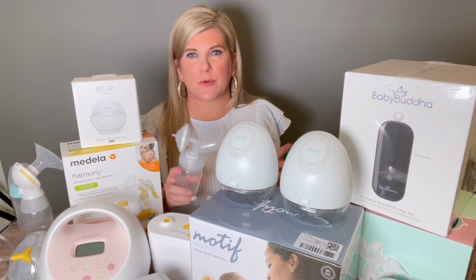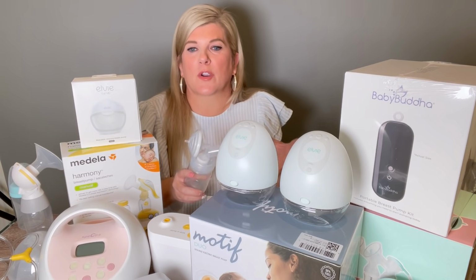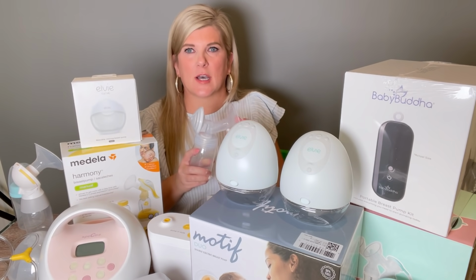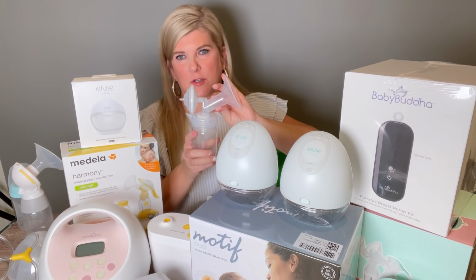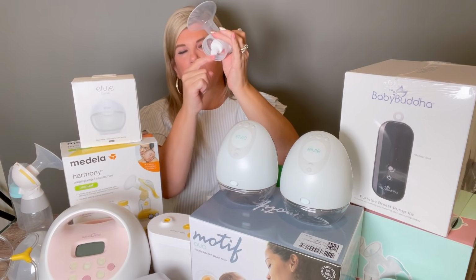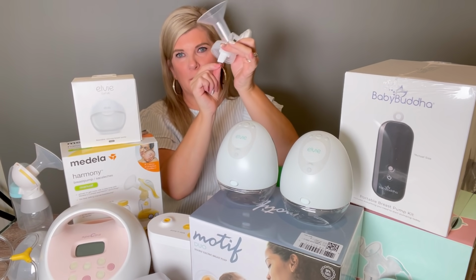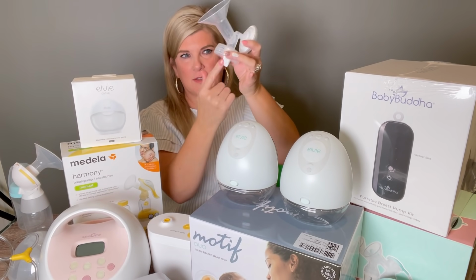And when you're in the hospital or as you get established with using a breast pump, if you're working with a lactation consultant, then they'll be able to tell you if it's not working. But again, most moms are just fine with a 24 millimeter. And then you're going to get these duckbill valves. This is a little valve. Actually, this controls your pump quite a bit. And you're going to get a set of these.